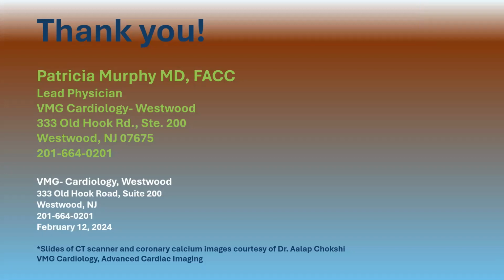Someone is asking about a nuclear stress test. Would that be used to further determine the risk factor after a high calcium score? Right, so that's a good question. So when you have a score over 100, over 400, and remember that person that we showed, 1,700 plus. So if you have a score over 400, then you talk about short-term risk and lifetime risk. Your short-term risk of having a cardiac event is higher.